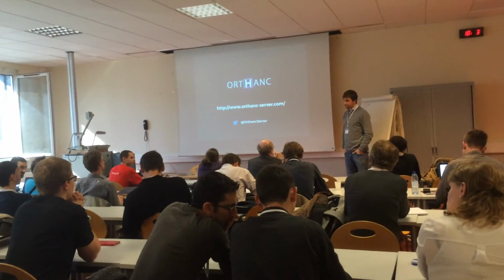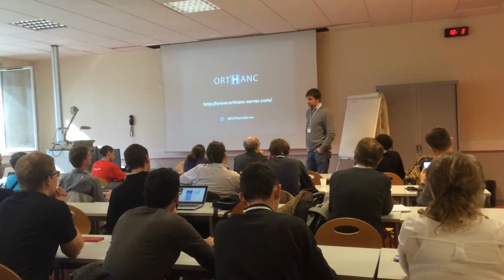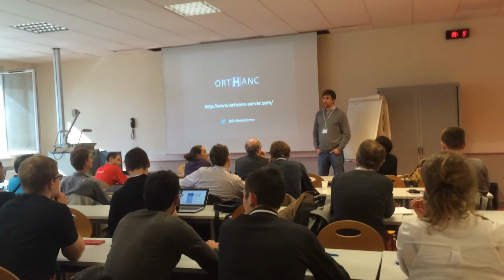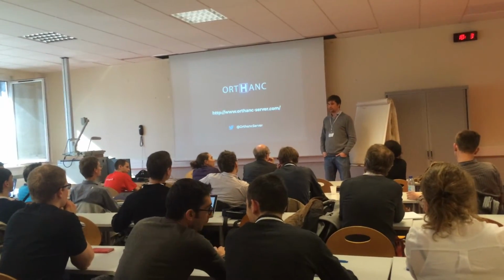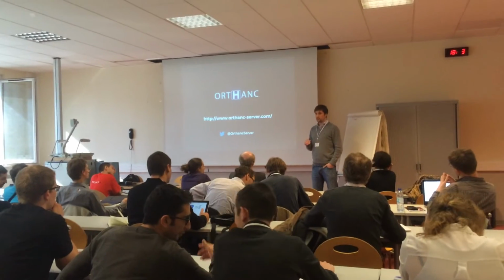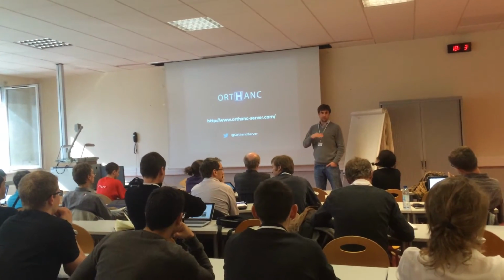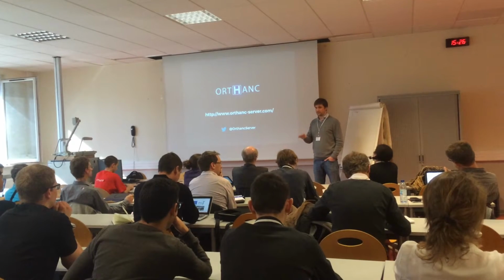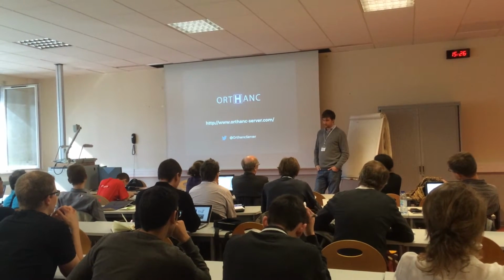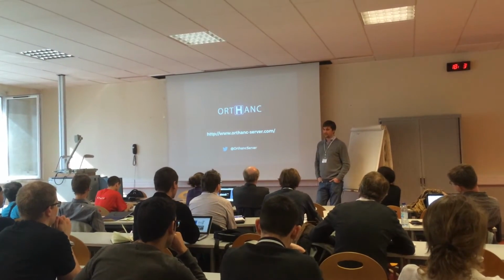So when you develop with annotation and the reports, you are creating presentation states and something which is specific. We've analyzed different options for that. For the moment, it's mainly prototyping that we're doing. We analyzed 3 options: either storing it into the DICOM file in one of the tags, or storing it into the application that's running next to it. Or the third option was to do it in a Firebase, but that is quick and dirty, so that will never be a viable option. It's perfectly documented in DICOM by creating a presentation state. Absolutely. And which is what we're eventually going to do, of course.